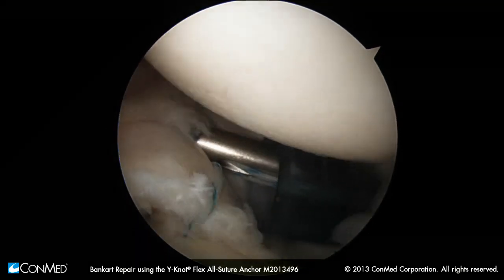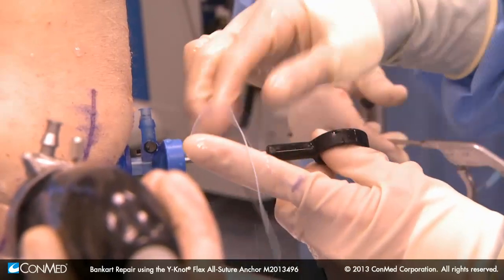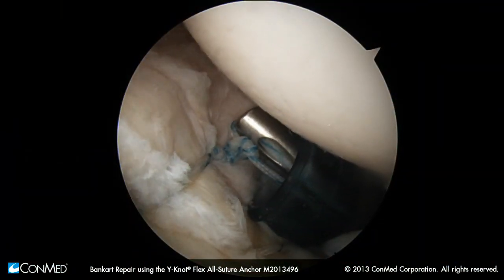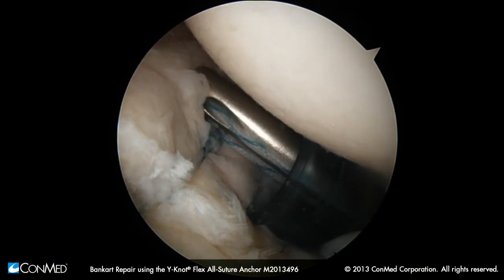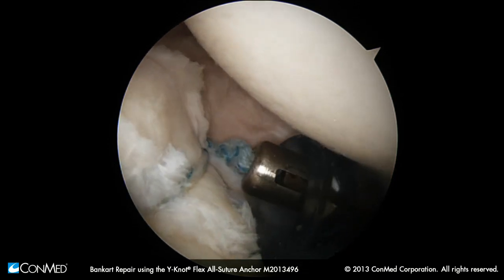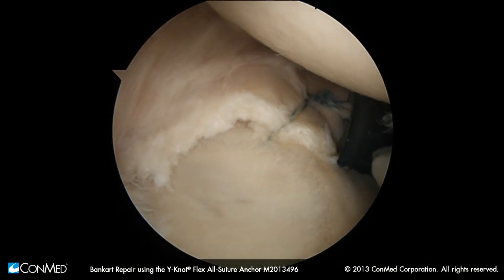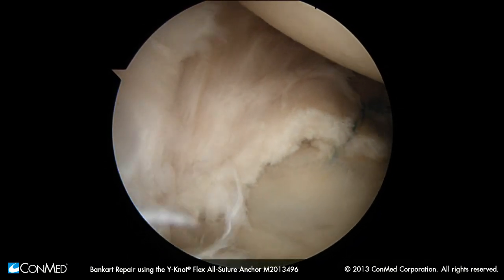Once we get it to where we want it, we'll put three half hitches generally on every limb. We'll watch that knot right there — you can see that's a square knot. We're going to go to the anterior superior portal now. We've got our good six, even 6:30 anchor there. Now we want to get up here anteriorly.